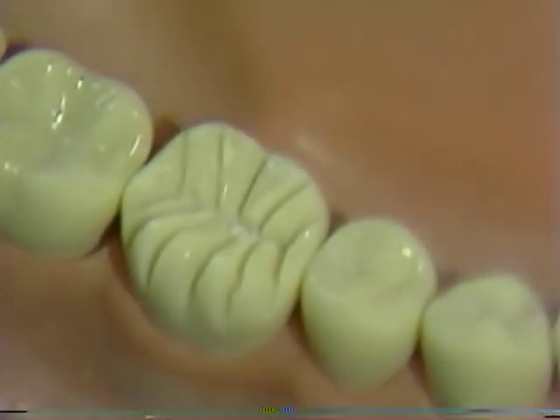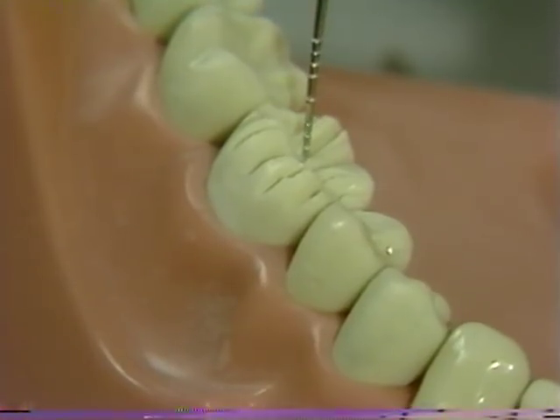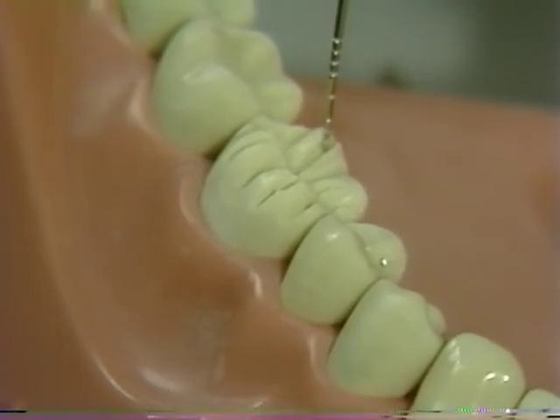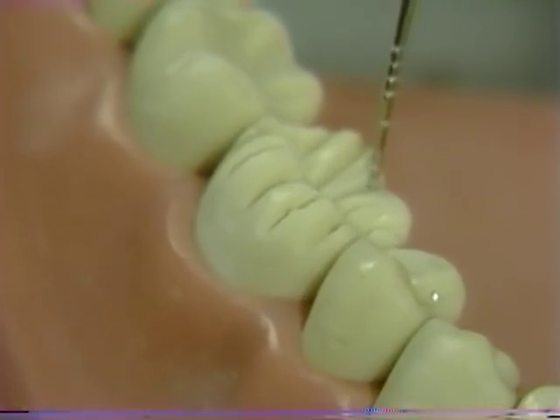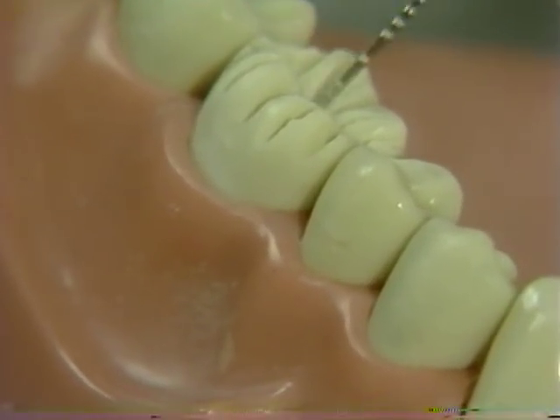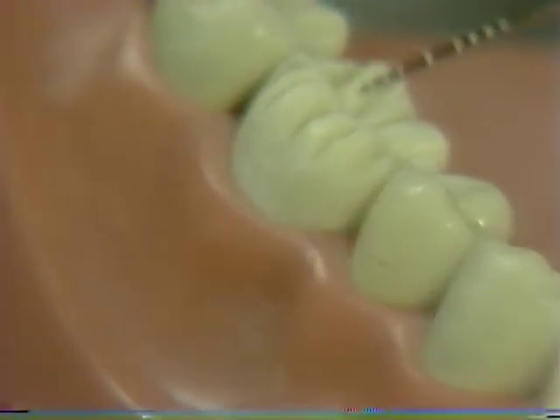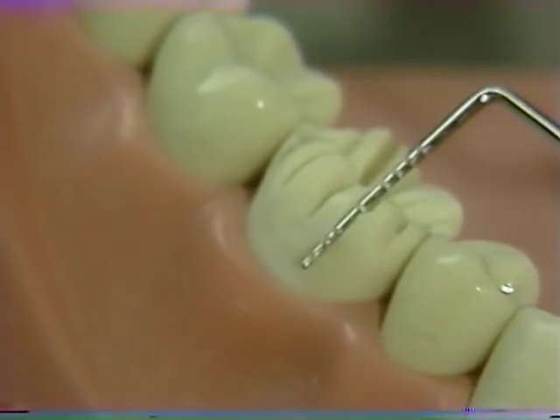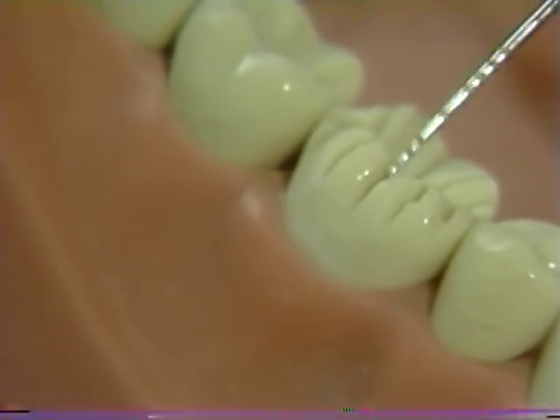The primary area of reduction is at the cusp tip only. You can use your peri-probe to verify the depth of these grooves — approximately one millimeter in all of the lingual grooves and approximately one and a half millimeters on the buccal aspect. Note, once again, that as the peri-probe is placed in the buccal-facing grooves, these grooves fade out towards the cervical.